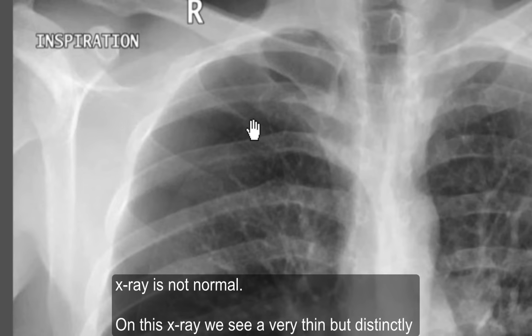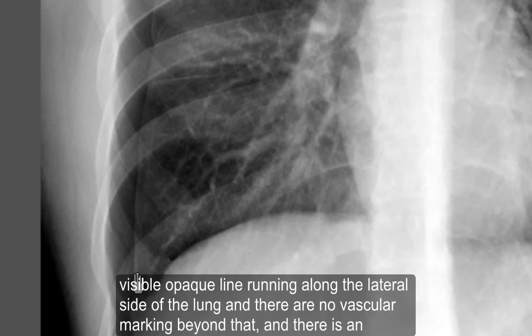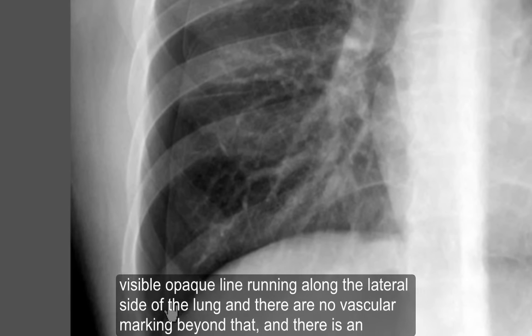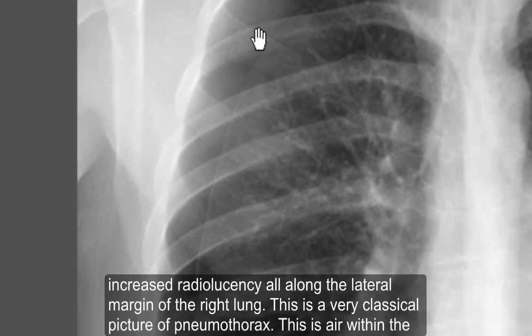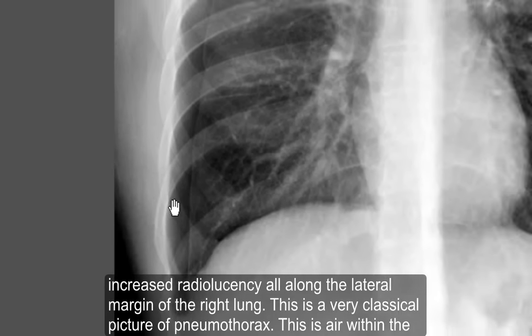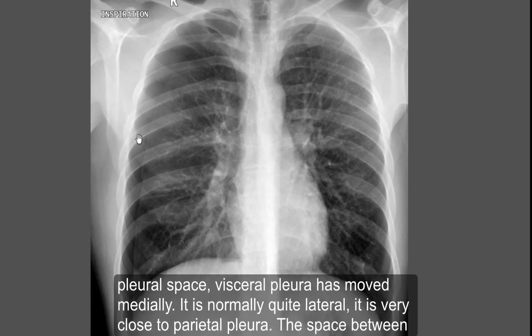On this X-ray we can see a very thin but distinctly visible opaque line running along the lateral side of the lung, and there are no vascular markings beyond that line. There is an increased lucency all along the lateral margin of the right lung. This is a very classical picture of pneumothorax — air within the pleural space. The visceral pleura has moved medially; it is normally quite lateral.